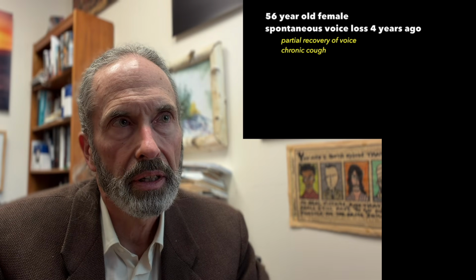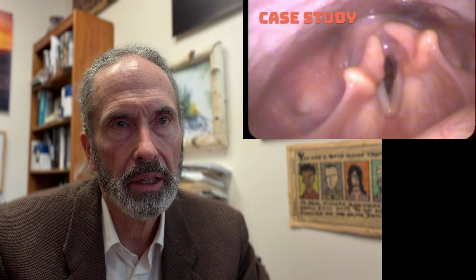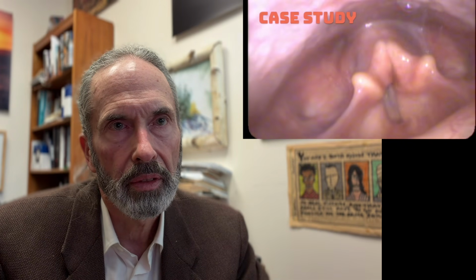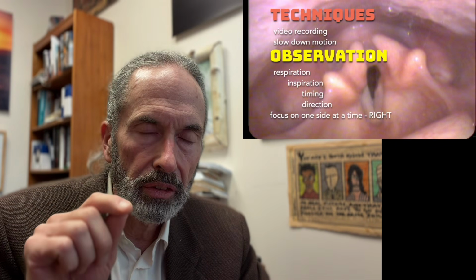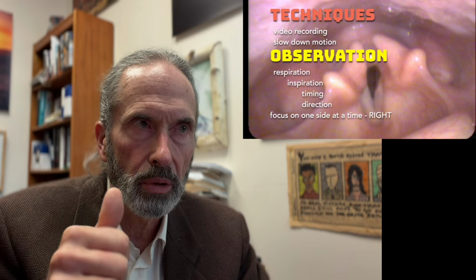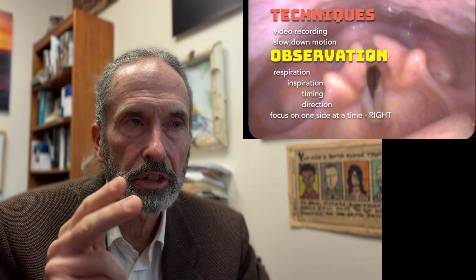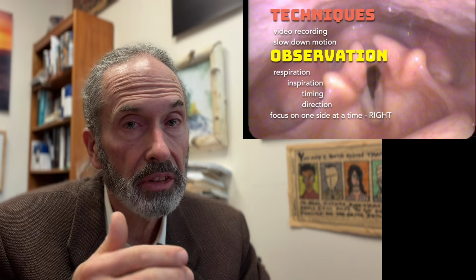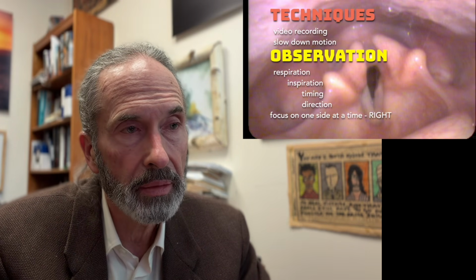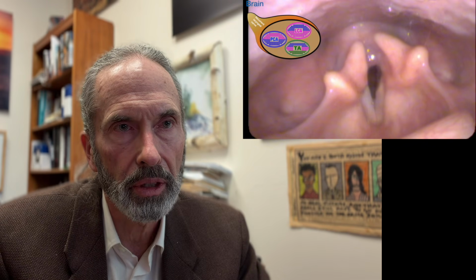Here we have spontaneous voice loss 4 years ago. And now when we look at this, you might say this is quite confusing. Look at the twitchiness of the right side. But the key here is to focus. And we'll do that by recording it, slowing down the recording, watching respiration, specifically focusing on inspiration. Is the timing of adduction correct? And we're only going to look at the right side initially to see what's going on.